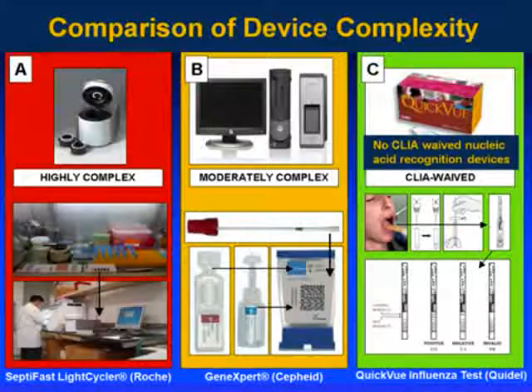Moderately complex and highly complex tests are scored based on a variety of criteria. These scores depend on the level of knowledge of the operator to perform the test, training and experience, reagents and material preparation, characteristics of operation steps, calibration, quality control, and proficiency testing materials, as well as test troubleshooting, maintenance, interpretation, and judgment. This slide compares pathogen detection methods relative to their level of complexity based on CLIA definitions.